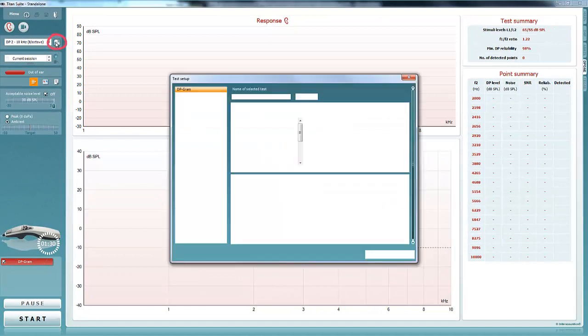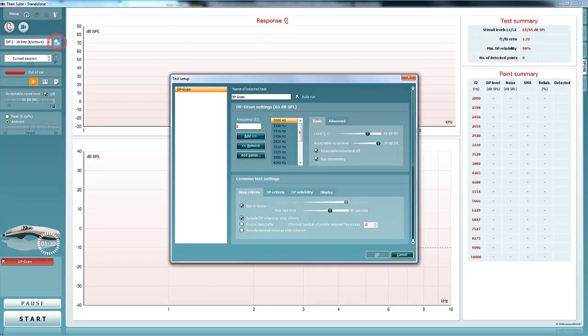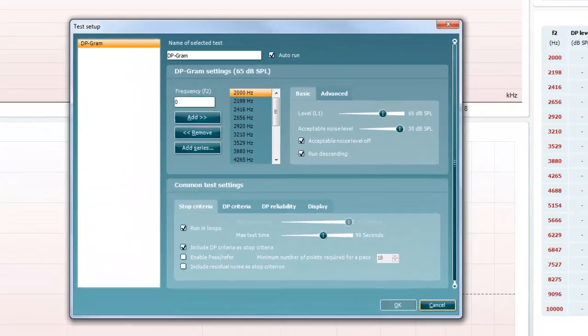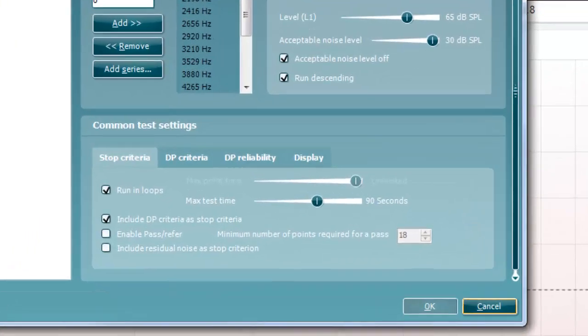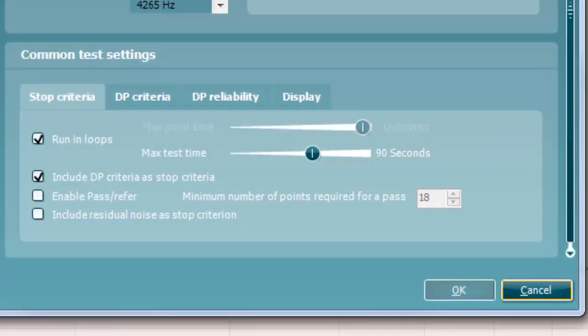The first step is to open the temporary settings tab. A pop-up screen will appear titled Test Setup. The area of interest for this video is the box titled Common Test Settings. In this box, there are four tabs that can be accessed.